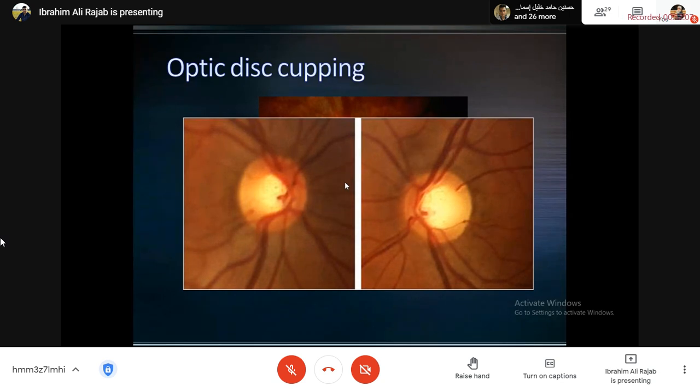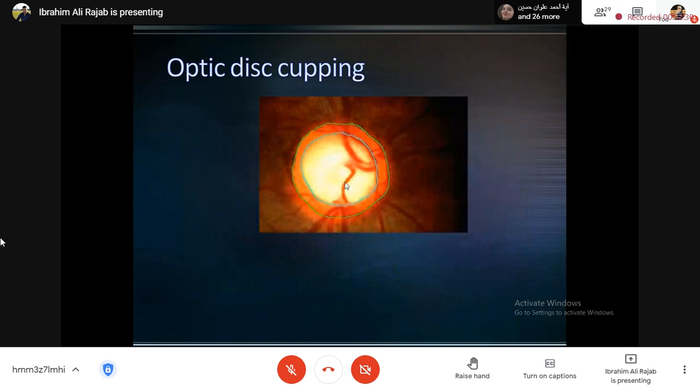it may be a sign of a serious and major disease in ophthalmology called glaucoma. So this is maybe a sign of optic disc damage. شكرا آلاء فلاح. دكتور، الصورة الأولى كانت يعني كديفرنشال diagnosis إنه glaucoma. Yes, this patient may be glaucomatous because glaucoma is a collection of criteria.